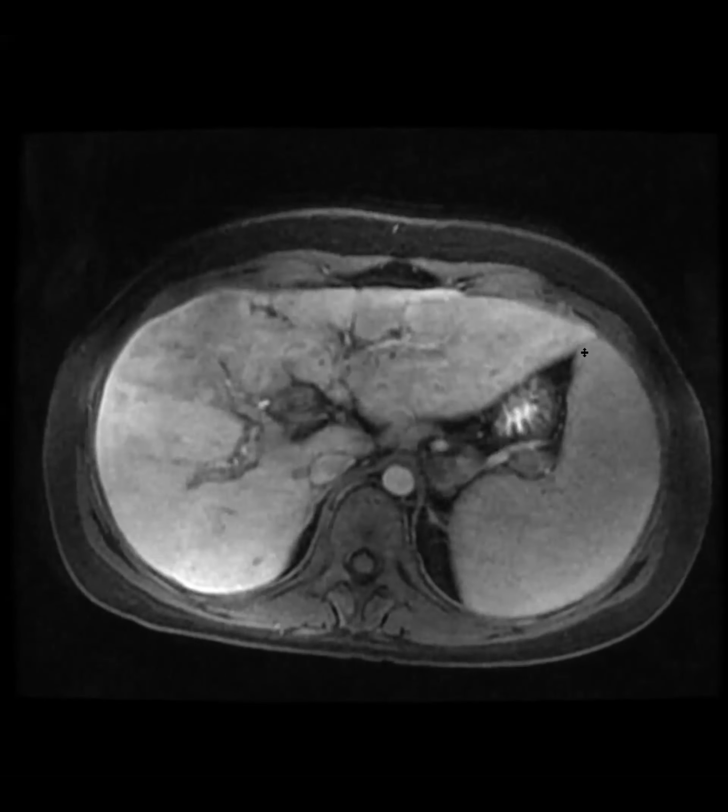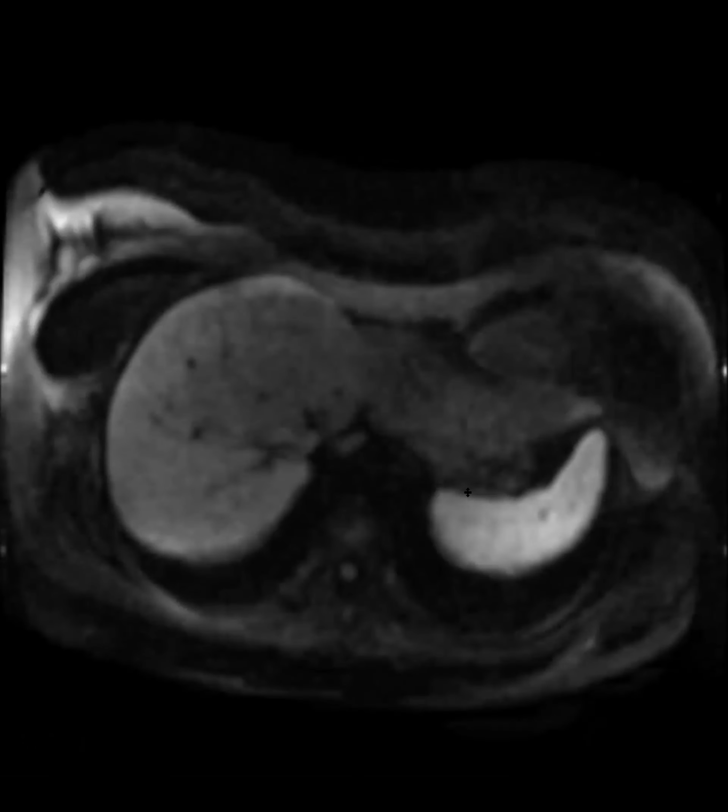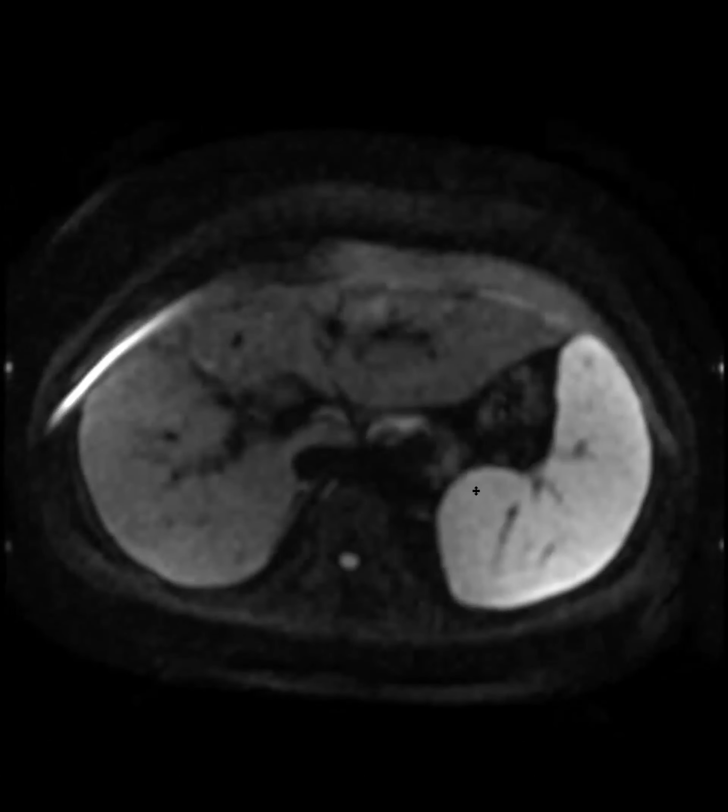Did they say anything about whether it's a superficial spreading cholangio, or is there an actual mass that we just can't see here? Like a rounded mass, or mass forming, multifocal mass forming. Yeah, so it was mass forming. It wasn't an intraductal one. Wow. And nothing on diffusion? Here's my diffusion. Kind of unremarkable. That is really scary.